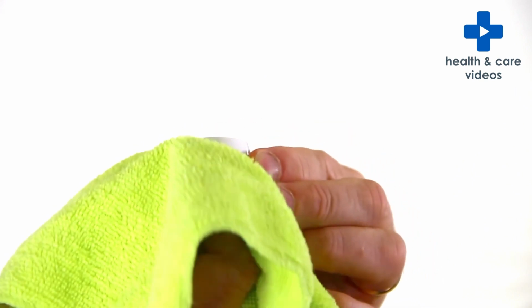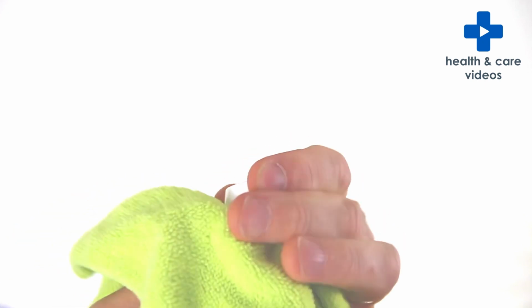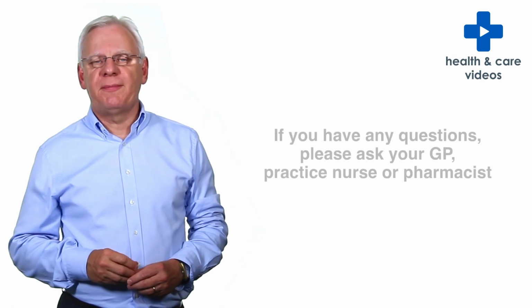Wipe the inside and outside of the mouthpiece with a clean, dry, lint-free cloth to remove any powder residue. Please do not wash your Novolizer Inhaler with water.